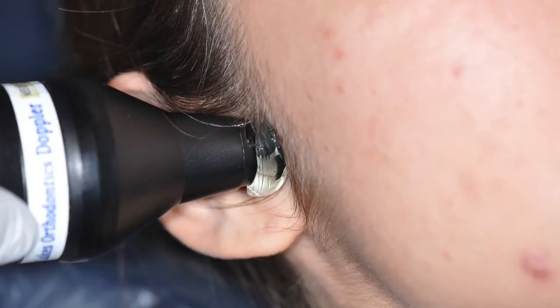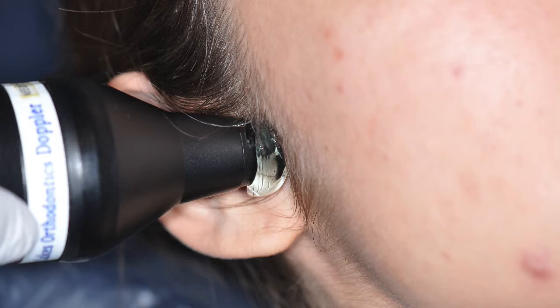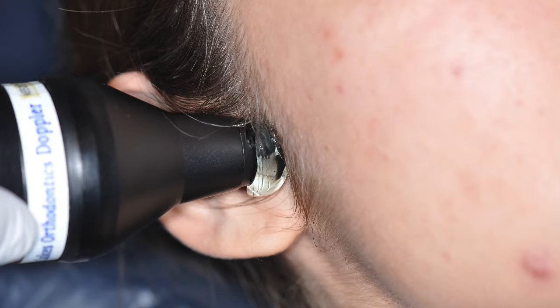In the next segment, we're going to actually listen and observe a Doppler auscultation of the joint. Once we've finished our palpation of the joint — we've palpated the lateral pole, we've palpated retrodiscal tissue — we can now answer the question: is there inflammation in any of those tissues? The capsule, the synovial membrane, the retrodiscal tissues.